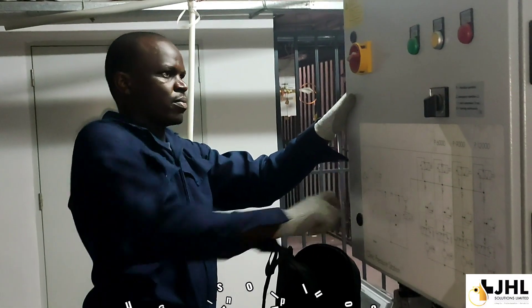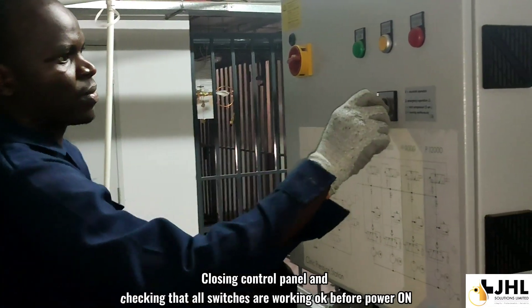Closing control panel and checking that all switches are working OK before power on.